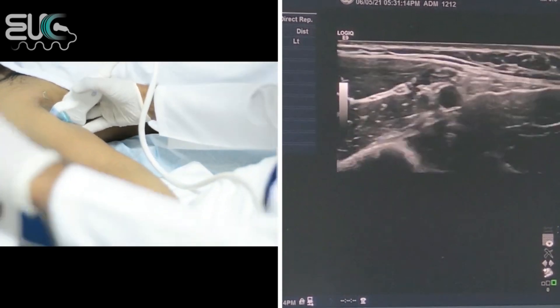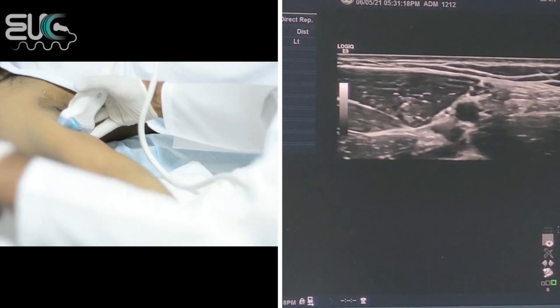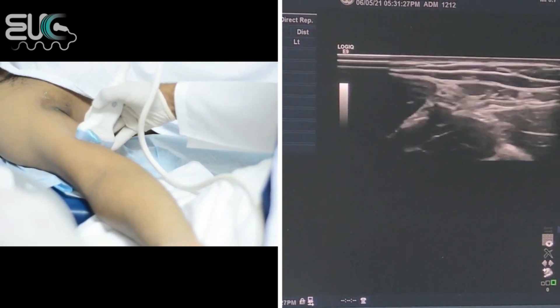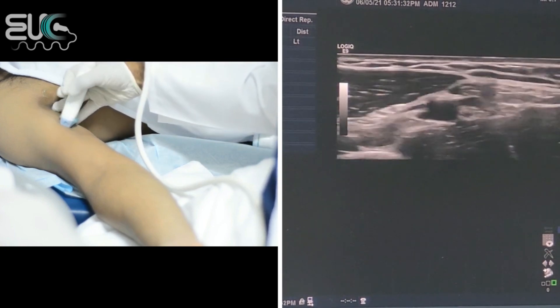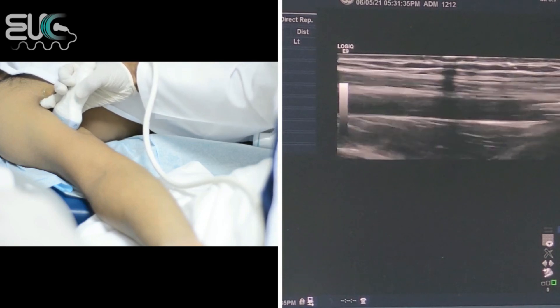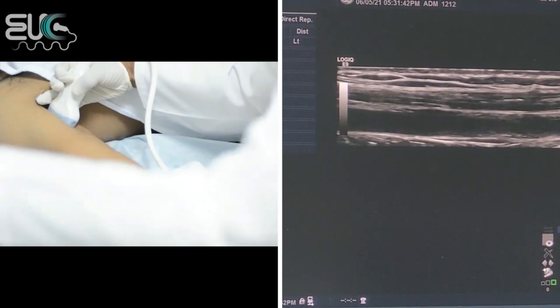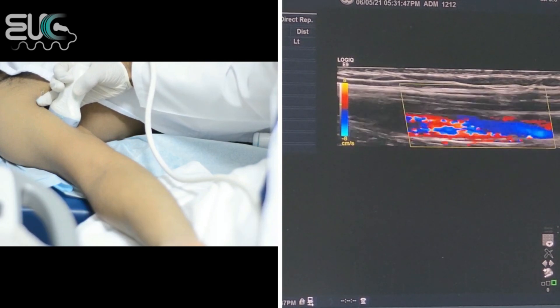After that, at the arm, I will follow the brachial artery. If I follow it on the transverse view, here we have the brachial artery. Now I will start to take it at the upper arm with the sagittal plane. Then with color — I have a good laminar flow.